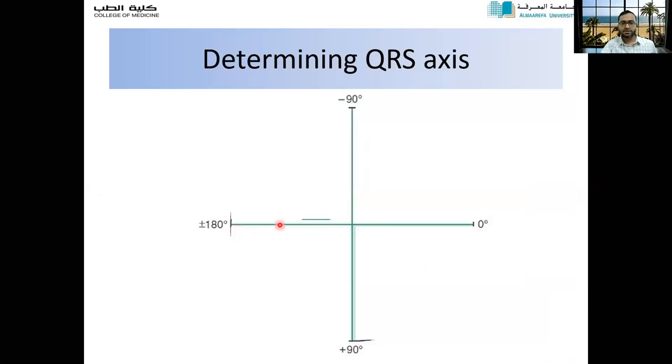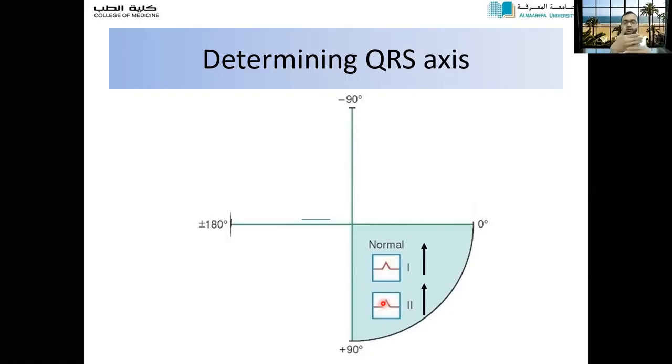So let's see some crude method. Lead 1 and lead AVF, the two leads you should not forget. Always look at them. By mistake, 2 is written here, but please correct it, I apologize for writing this wrong. It's AVF, the second lead is AVF here. Always put lead 1 above and lead AVF below. In your imagination, whenever you see the ECG, put lead 1 above and lead AVF below.